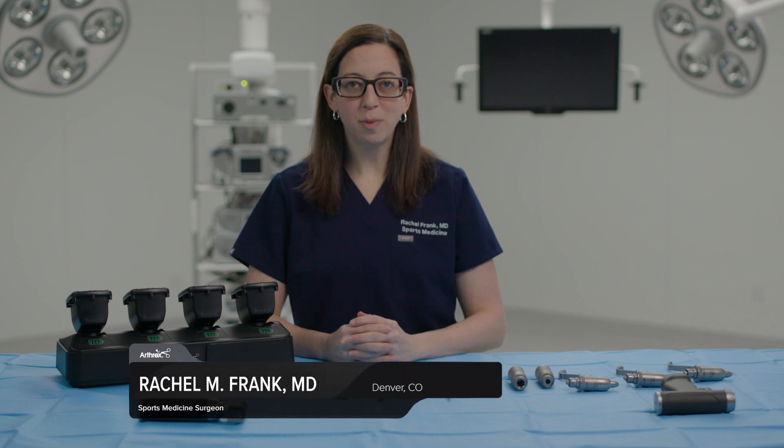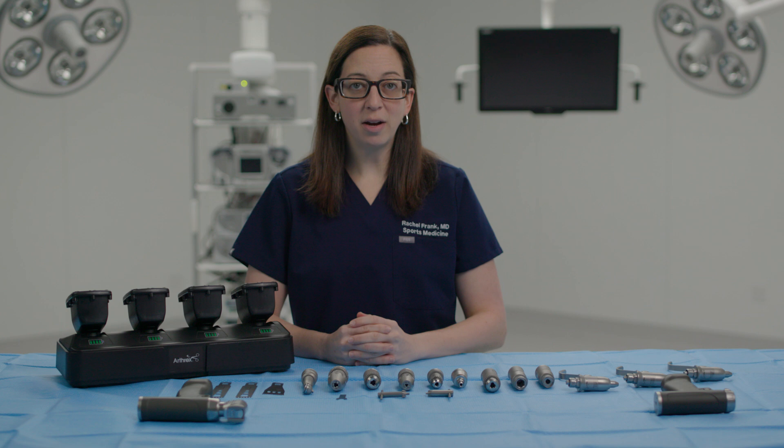I'm Dr. Rachel Frank, a sports medicine and shoulder surgeon from the University of Colorado, and I would like to provide an overview of the Synergy Power System. This system was designed and developed in-house by Arthrex product development engineers and is assembled at the manufacturing facility in South Carolina. I'm excited to walk you through the system and my favorite features of Synergy Power.